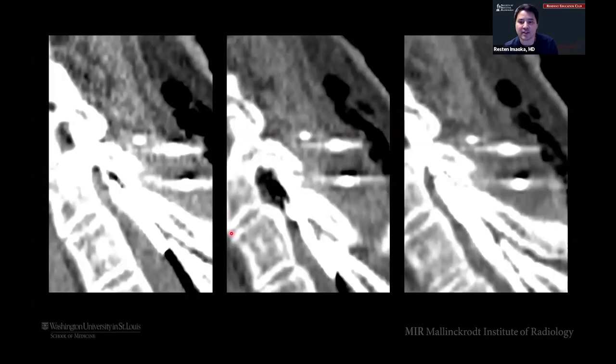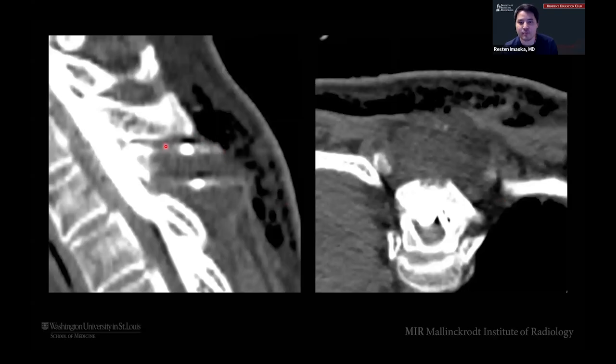And this is kind of what that looks like sequentially, right? So you can see these are the streaks from our needles here. And then as the cryoablation goes on, you can really see that ice ball start to form and really measure it. And that's really the benefit of cryoablation, right? Aside from the size, because that's bigger too, the ability to really see what you're ablating and measure it is ideal. This is what that looks like at the end, right? Big ice ball around that entire spinous process met.